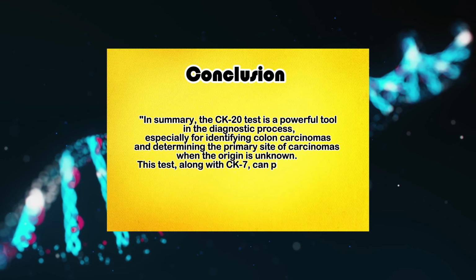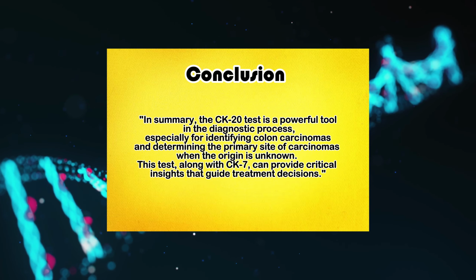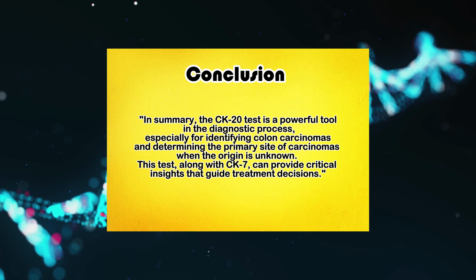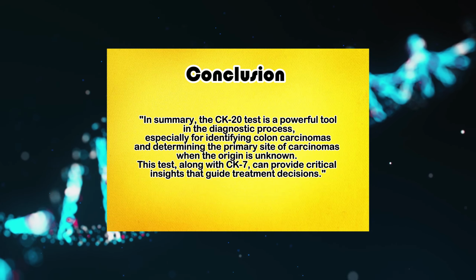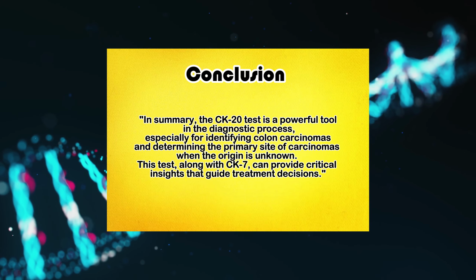Conclusion. In summary, the CK-20 test is a powerful tool in the diagnostic process, especially for identifying colon carcinomas and determining the primary site of carcinomas when the origin is unknown. This test, along with CK-7, can provide critical insights that guide treatment decisions.